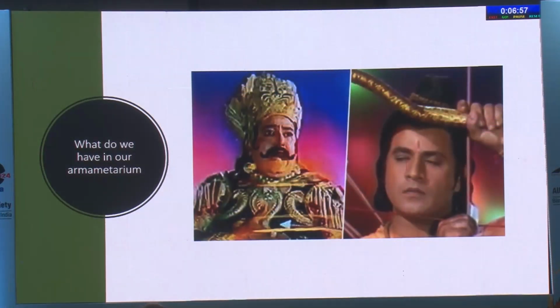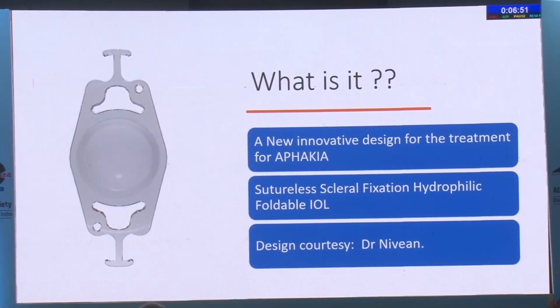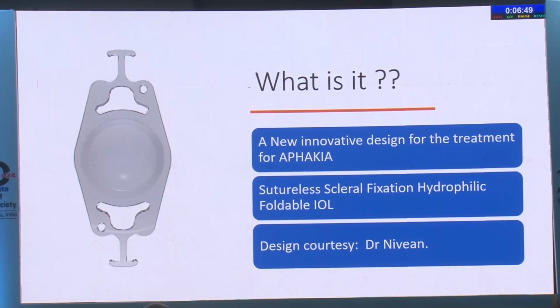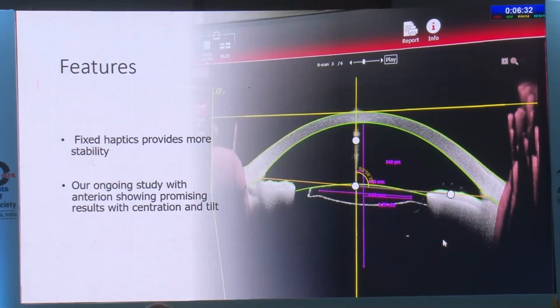So what do we have in our armamentarium in that scenario? So comes into the picture the scleral tuck IOL. This is the CMT flex model I will be discussing, courtesy Dr. Nivian for the design. Sutureless, it is a scleral fixated hydrophilic and foldable lens. It can be placed horizontally and vertically. It provides us with a sutureless scleral fixation. It has a large optic diameter and can be used in various sizes and shapes of the pupil.